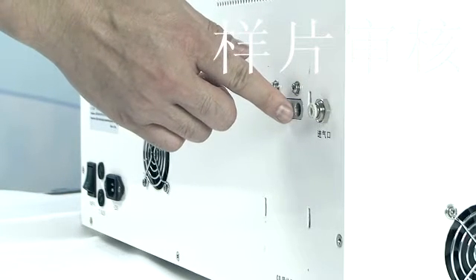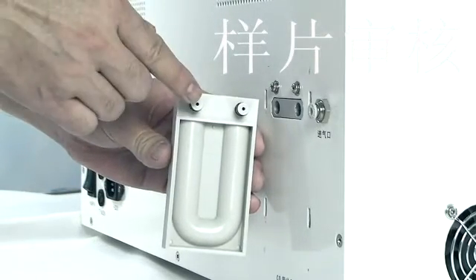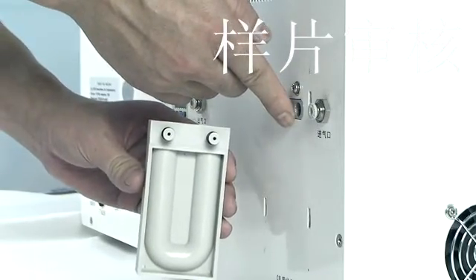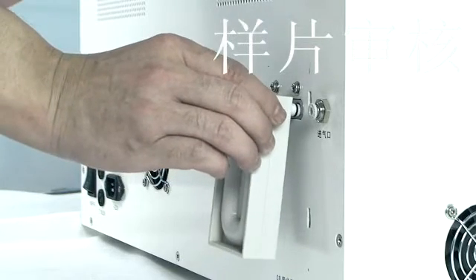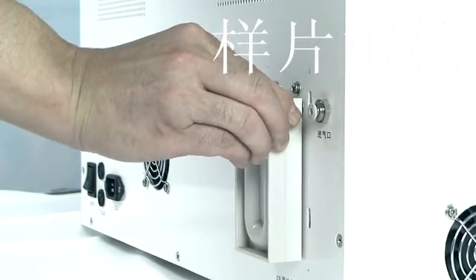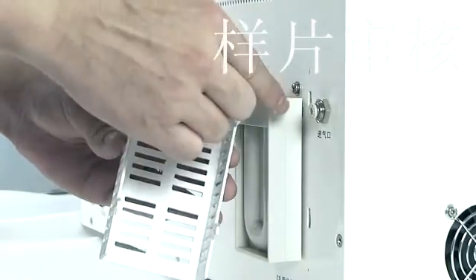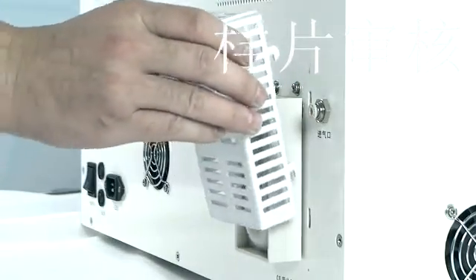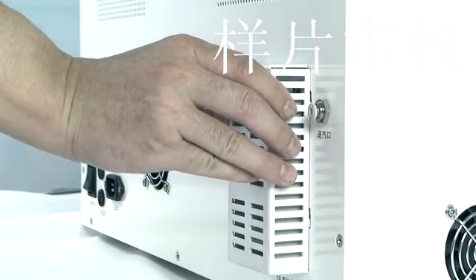Installing the filter: remove the protective cap of the filter connectors. Insert the filter into the filter interface, making sure to insert it all the way to the end. Insert the filter cover into the cabinet of the instrument backplane and push down the filter cover to make the instrument backboard secured by the filter mask.